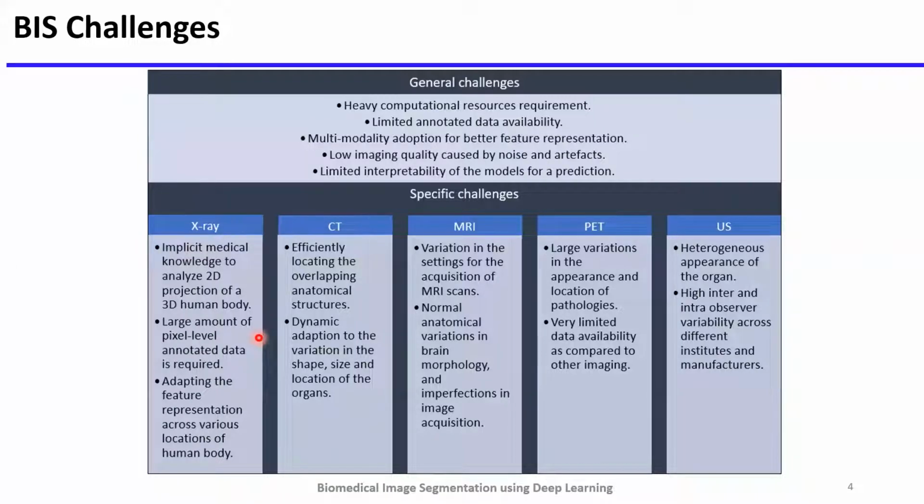is also one of the challenging tasks, because you find everywhere that an MRI scan of a part of a person's body from one diagnostic center is different from another one. That is the biggest reason why MRI experts are needed. And the same challenges apply if we go for the digital version, like suppose you want to automate all these things. Again, we'll face the same problems. That is also one of the biggest challenges.